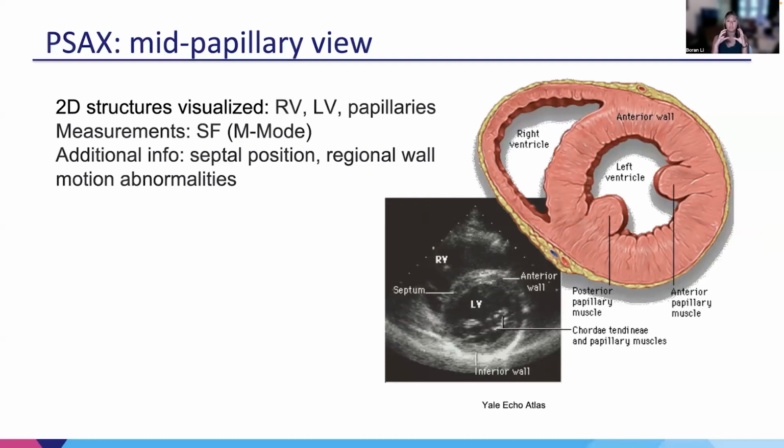And if it doesn't all come together and release pretty uniformly, then you know that you have regional wall motion abnormalities. And something that someone taught me, which I thought was really easy and quick, is if you cover different quadrants manually with your hand while it's playing, you can see if it's contracting towards a center point.